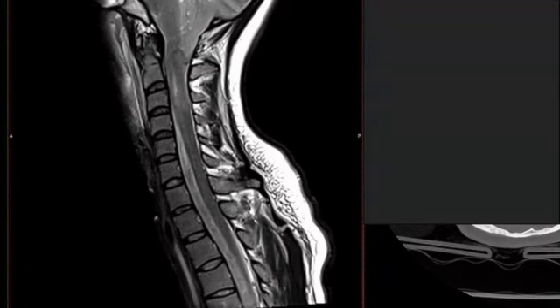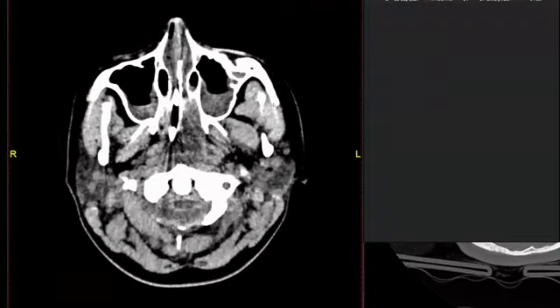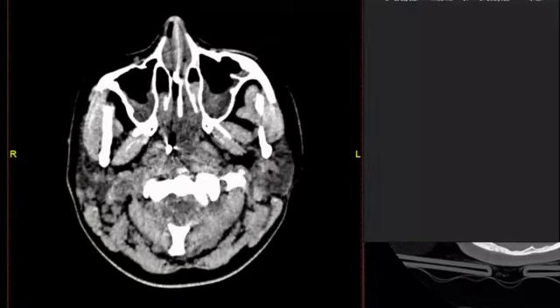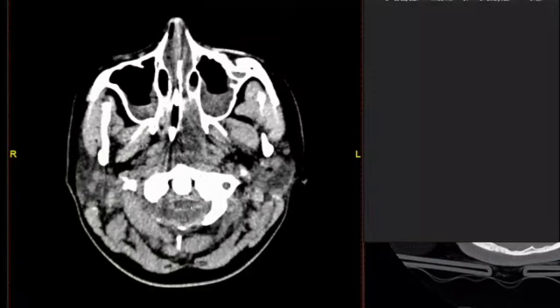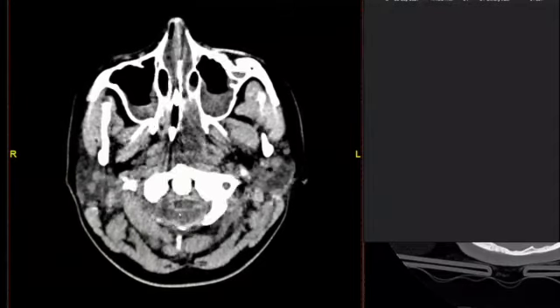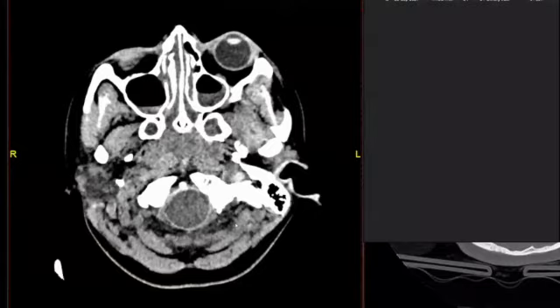And her brain CT. So we'll start by looking at the pre-contrast scan. It's nicely lined up now because she's intubated and ventilated. Coming up immediately, you can see the foramen magnum is full. There's the spinal cord anteriorly. There are some vascular structures and dura there, but behind it, those are cerebellar tonsils sticking through the foramen magnum. It's completely filled.